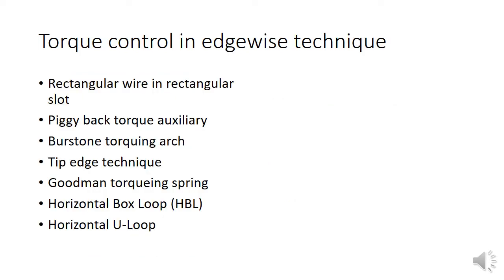Now let's have a look at different methods that we can use to control the third order position of teeth in edgewise technique. The last two methods are designed by myself, and the other 5 methods are currently used by many clinicians around the world.